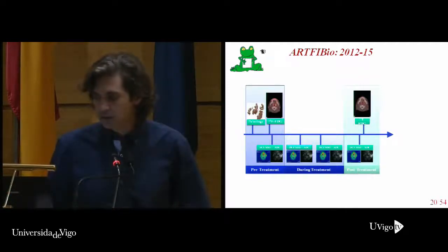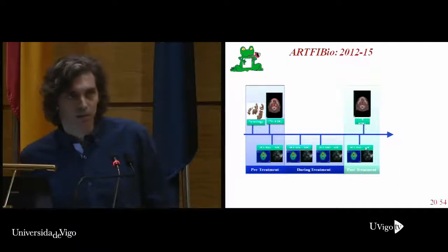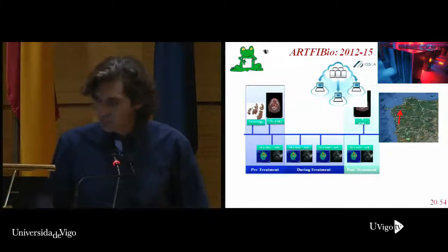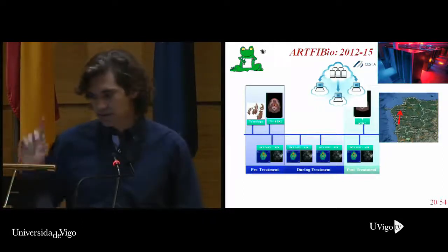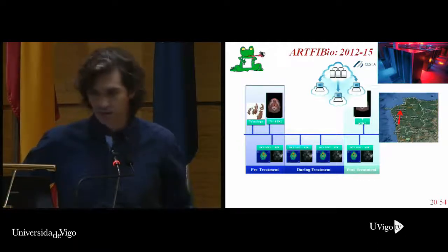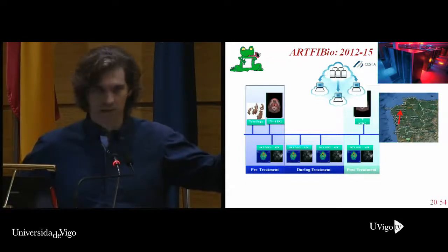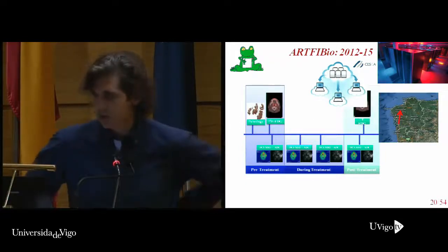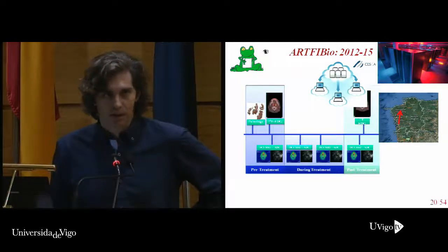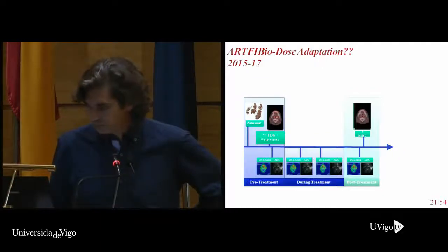Along the treatment, we also perform two other studies with dynamic contrast enhanced and with ADC. And 3 months after the treatment, we repeat the full initial study. All this information is sent to the Supercomputational Center of Galicia. We are here in Vigo, and they are in Santiago, 80 kilometers away. And they put all this information up for sharing with the whole scientific community.